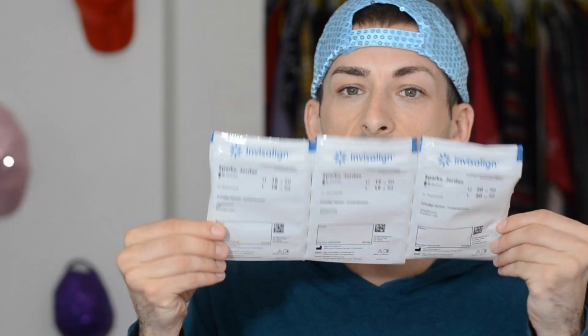I normally get either 5 to 7 new trays at each appointment, but today I just got 3, and they come in a package like this. You get a little bag that says which week you're on. I'm doing accelerated Invisalign with the PROPEL appliance right here.